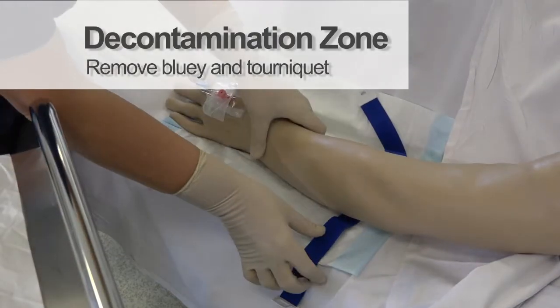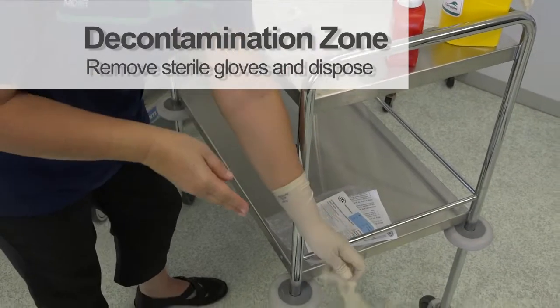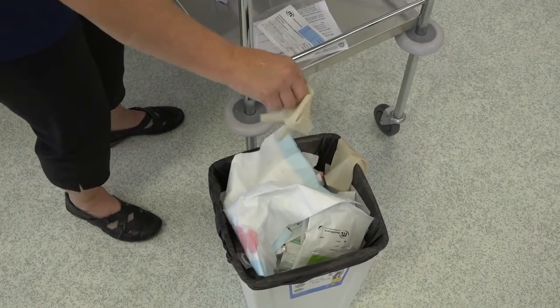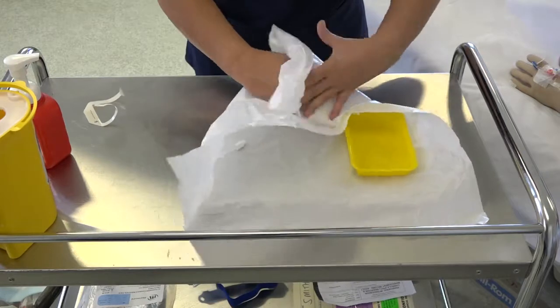Remove the bluey and the tourniquet. Remove your sterile gloves and dispose. Remove the packaging and retain your IV label.